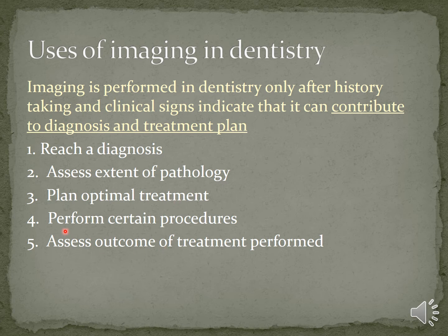Also, X-rays or imaging in general helps perform certain procedures. And last but not the least, to assess the outcome of the treatment performed. Let's say we've done a root canal treatment and you want to assess how well the treatment has been done. X-ray would be an excellent method of assessing the treatment of that particular case.